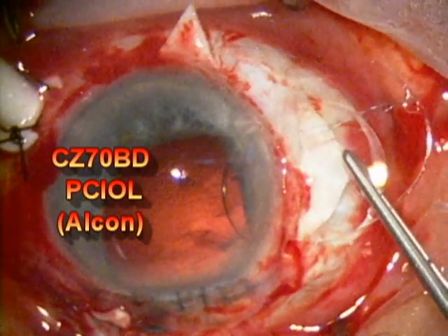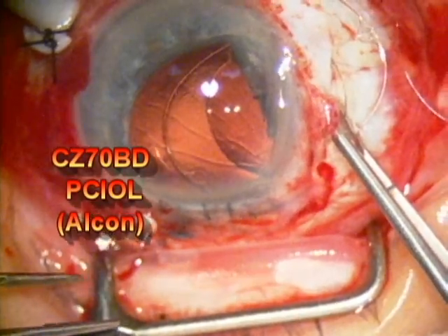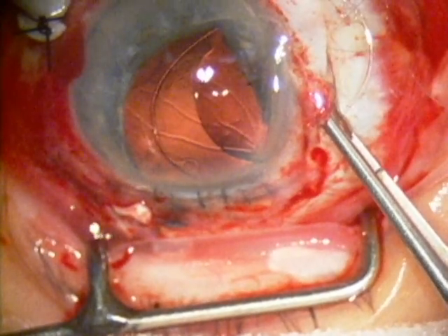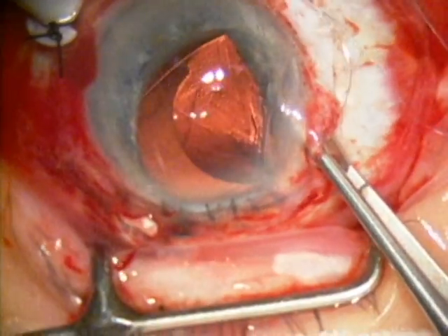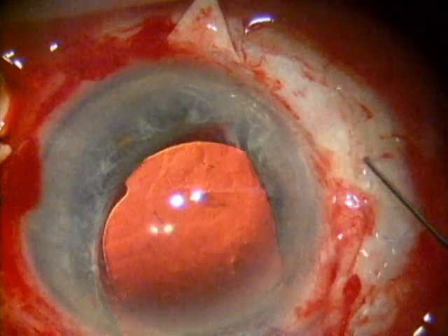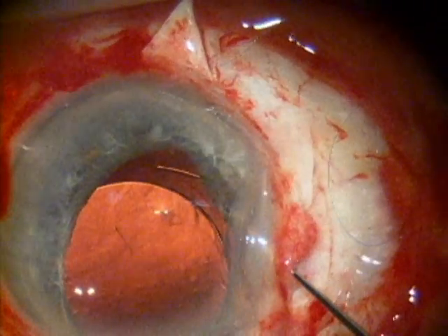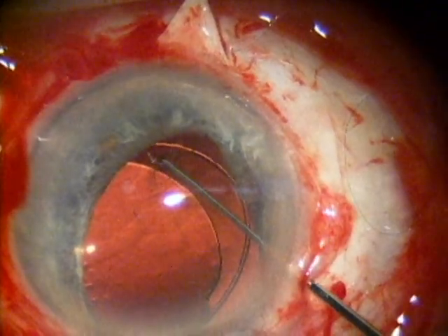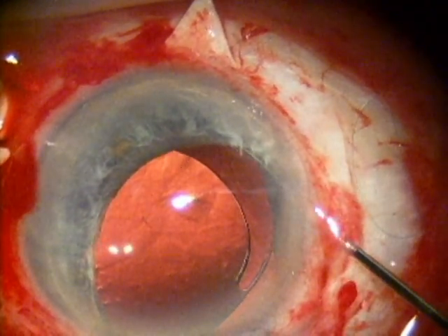The specific model of the intraocular lens is placed on the left side of the screen here. There you see the lens inserted into the eye. The sutures are kept relatively taut throughout the procedure because one of the things to avoid is tangling up these very fine sutures during the procedure. Once the lens has been inserted into the eye, the sutures are tied under those flaps and that's how the lens is stabilized inside the pupil.